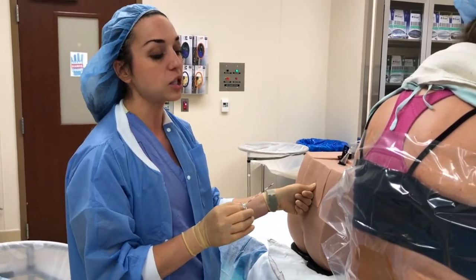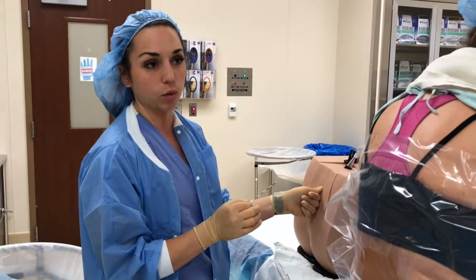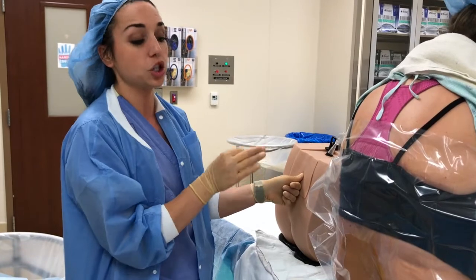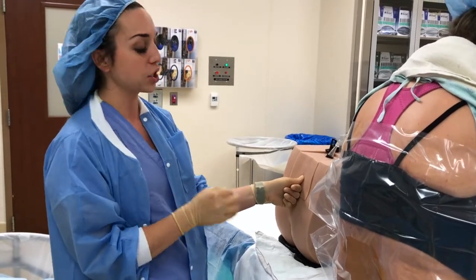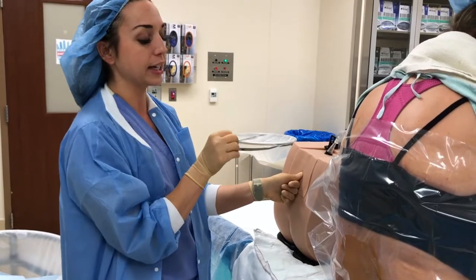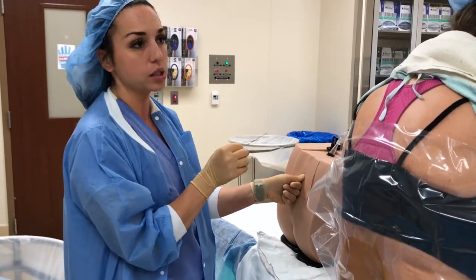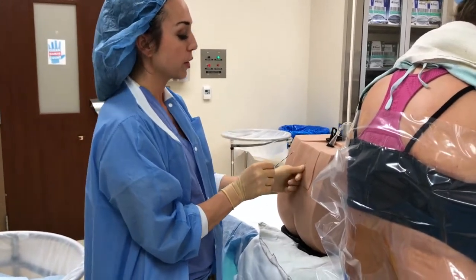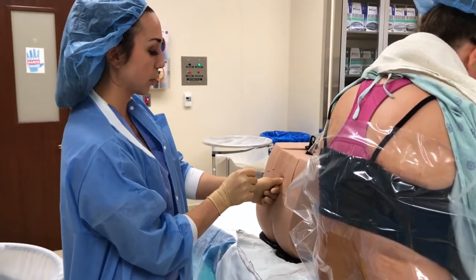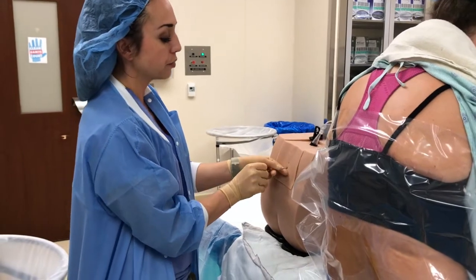I always tell patients that we don't have x-ray vision, that we're going off of anatomical landmarks, and so in addition to her position, the feedback that she gives us as far as if she's having pain sensation, that helps us guide our needle either left or right to the correct location. So that's important for them to know. So usually I'll say, okay, pressure in the middle of your back.